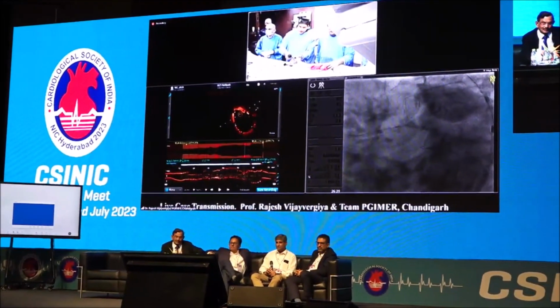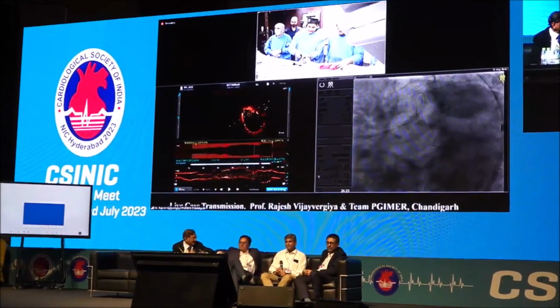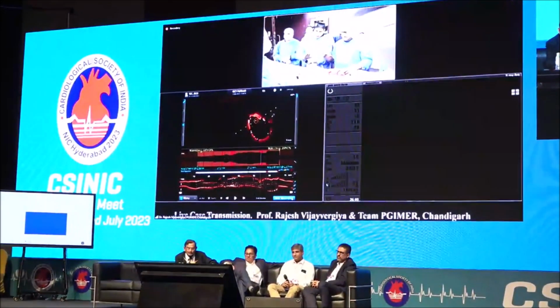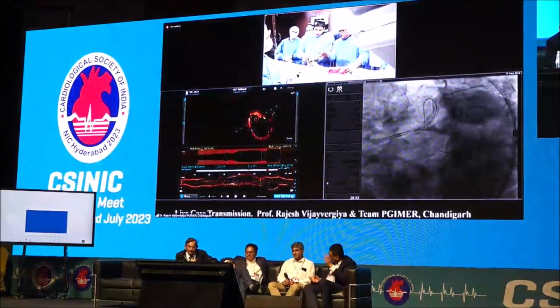Can we do an NC balloon after a DEB, sir? 18. So the question, negative. After the DEB, are you inflating the NC balloon, or is it another drug-eluting balloon? No, drugs are not in an NC balloon. 12. See, now the question is, we have already put a drug-eluting stent over there. 12.